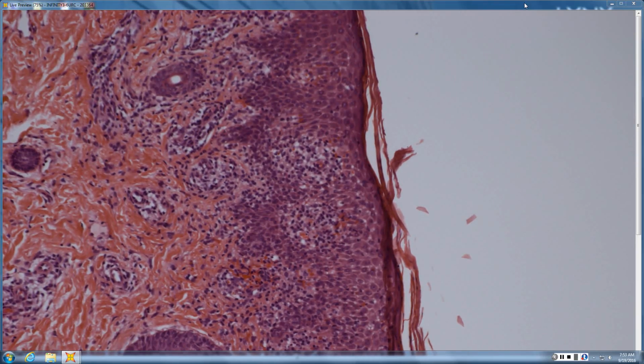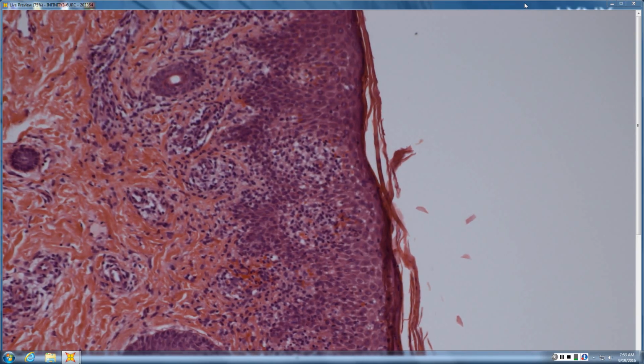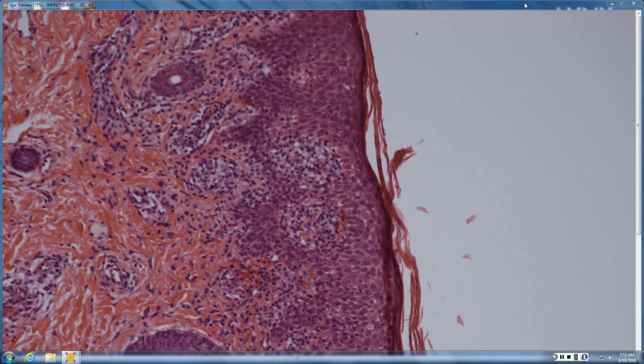Or maybe like PLEVA? Yeah, or pityriasis lichenoides. PLEVA tends to have a scale crust over it. PLC, pityriasis lichenoides chronica, tends not to have the scale crust. So this is maybe a little more PLC-like, but pityriasis lichenoides is exactly where this fits.